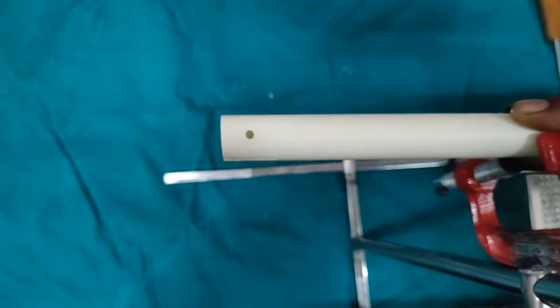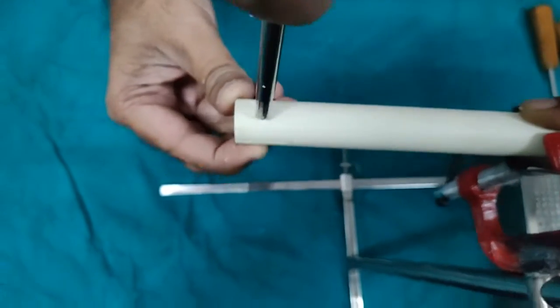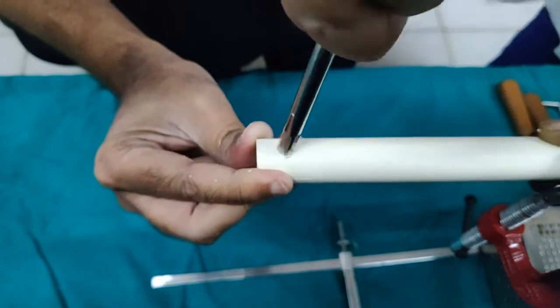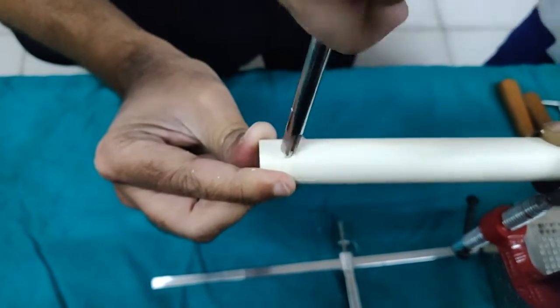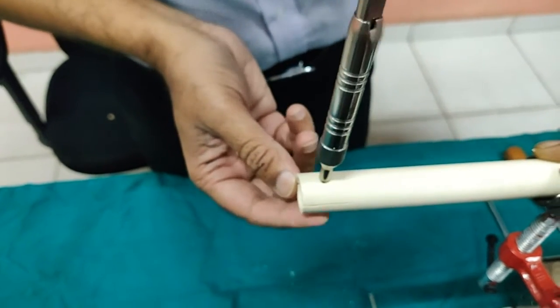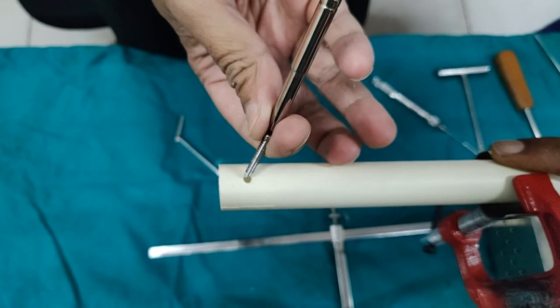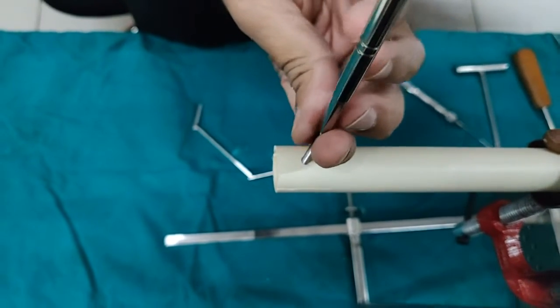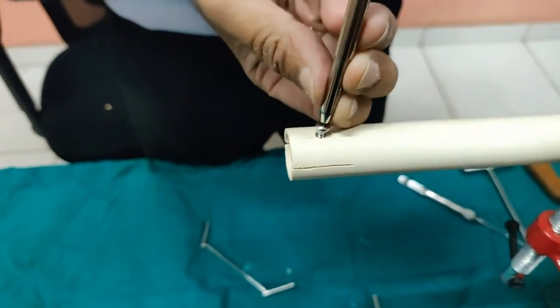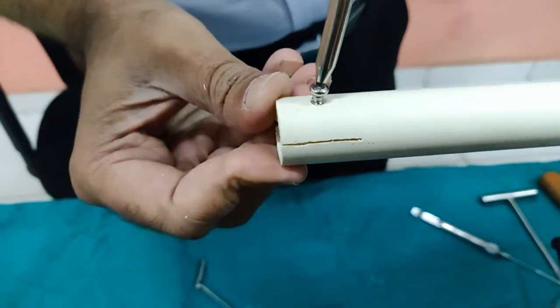After doing your pilot hole, you should use a countersink. It will be hard to demonstrate on plastic, but the idea is to use a countersink to create space for the screw head. Then you do the measurement — the next step is to measure the right screw length, then to do the tap. Once you have measured the size, it's important to remember your direction and send the screw in the same direction. Once we tighten this, the fracture gap you are seeing should slowly disappear.